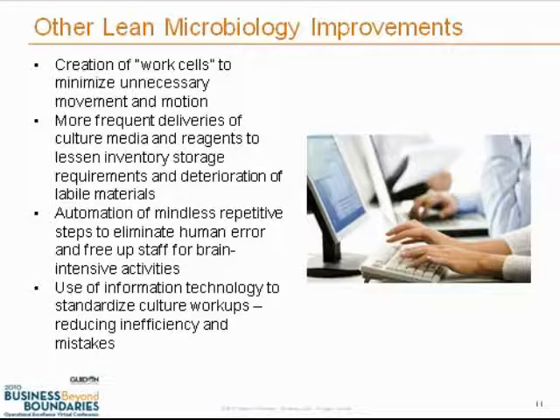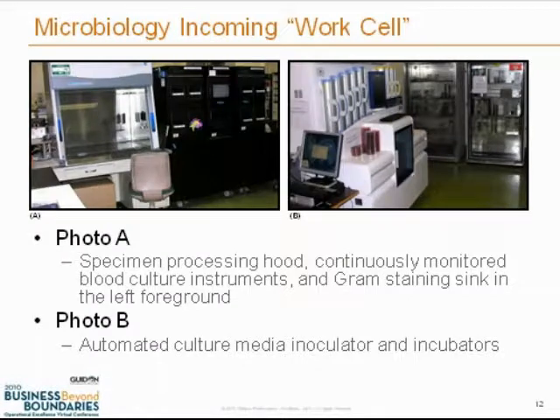The next slide, which is entitled Microbiology Incoming Work Cell, shows how we have reorganized the microbiology incoming bench in our laboratory. When I refer to microbiology incoming, I'm talking about the part of the laboratory that receives the specimen or culture, performs the microscopy, and inoculates the specimen to culture media.